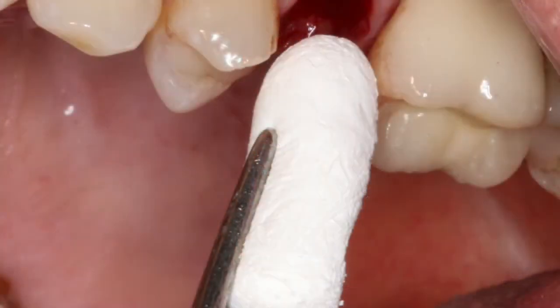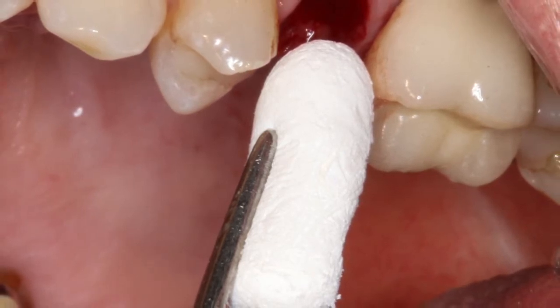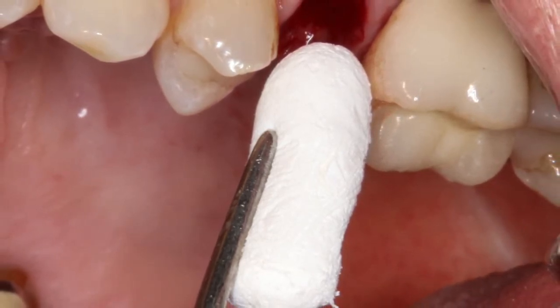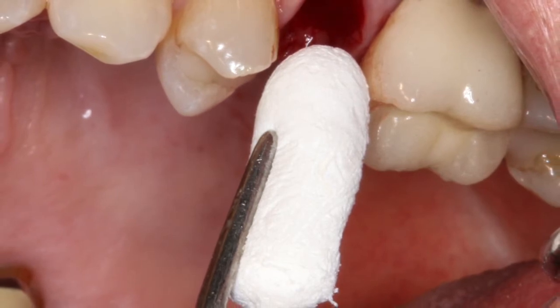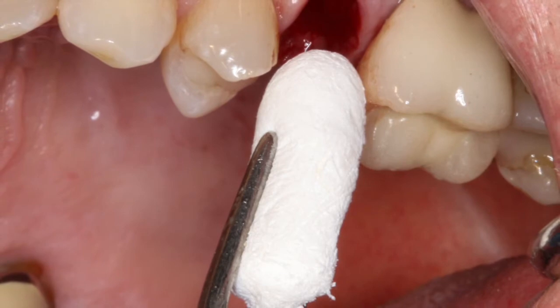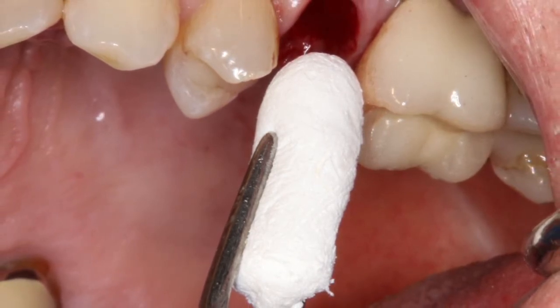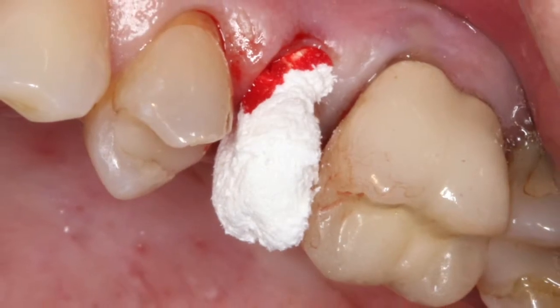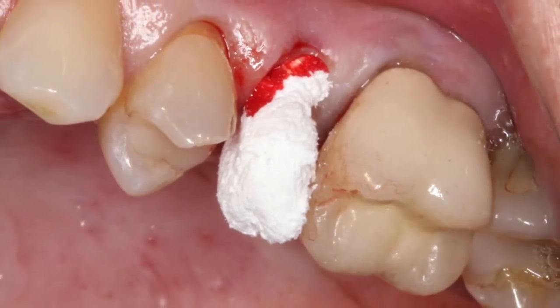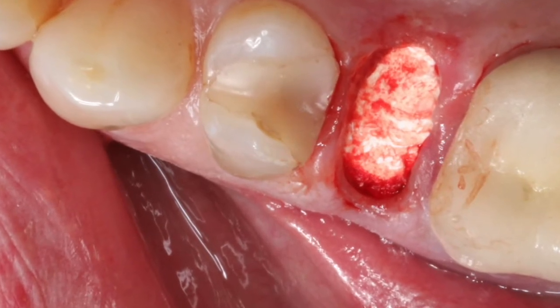In this situation, we grafted the defect after cureting extensively. We want to remove any granulation from the site. We want to remove any dark blood, purplish blood, from the site. And then we're simply taking an osteogen plug from Implident and also from Golden Dental, and placing this graft material into the socket site.